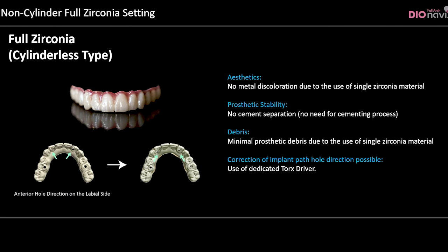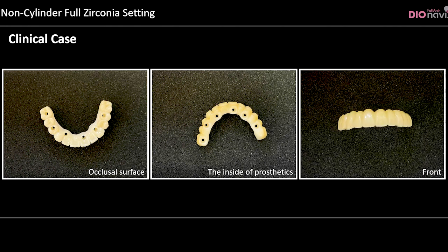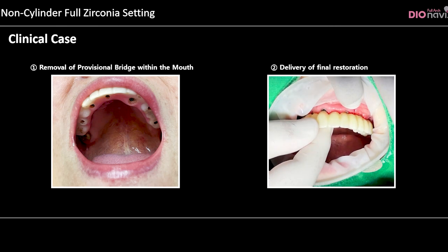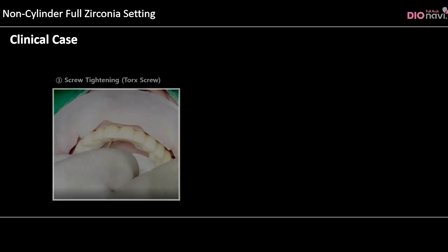Correction of implant path and hole direction is possible using a dedicated torx driver. The provisional bridge is removed and the final restoration is delivered. The following points need to be checked during the connection process.